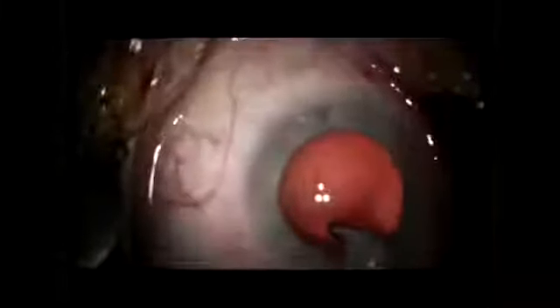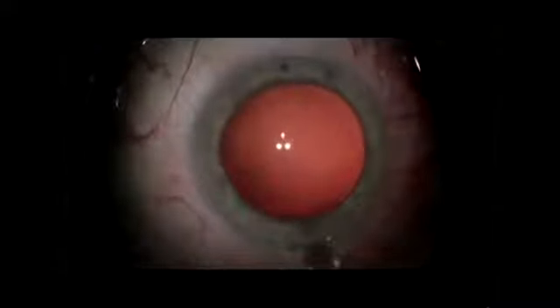Unlike the ab externo canaloplasty, however, here we do not use a circumferential suture tensioning of the trabecular meshwork or stenting of the canal of Schlemm. There is also no Descemetic window creation. Viscodilation expands the canal of Schlemm by 2 to 3 times its normal size, allowing more flow from the anterior chamber to the canal of Schlemm. In addition, it is felt that there is additional dilation of the collector channels to reestablish the flow in the distal drainage system. While MIGS currently addresses a small portion of the canal, it does not address the distal drainage system.